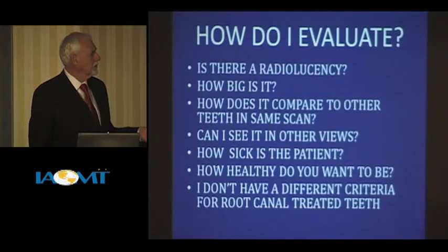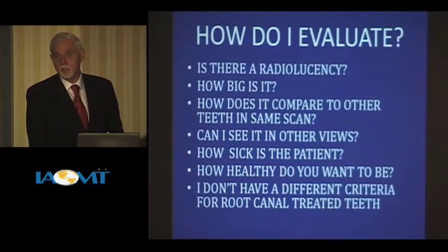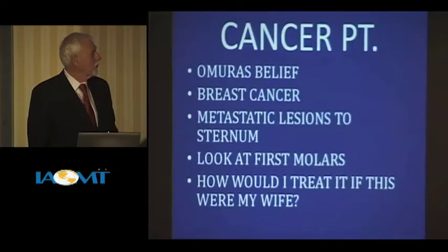How sick is the patient? How healthy do you want to be? I don't have a different criteria for root canal treated teeth. To me, they should look as healthy on the CAT scan as a non-treated tooth.